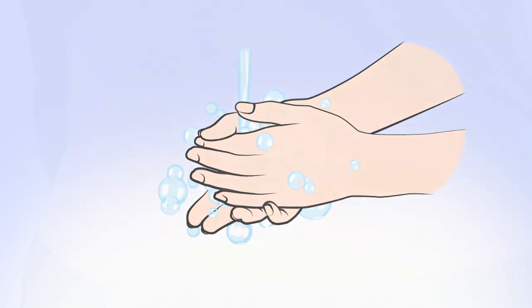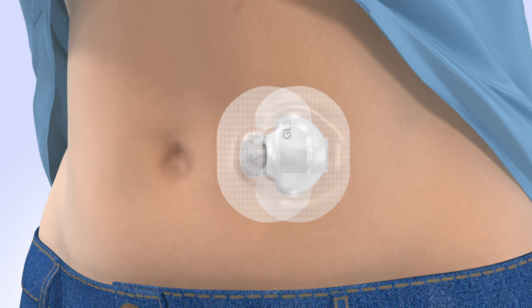Wash your hands before you begin. If you are currently wearing a sensor, you will need to remove it before inserting a new sensor.